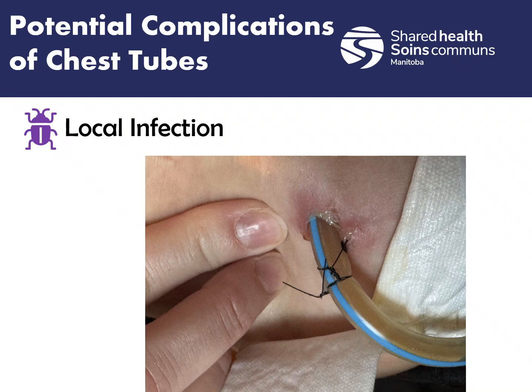If we didn't get a chance to check it before we transport for some reason, we want to make sure we take a look at it and notify the receiving facility that it looks like there could be some infection around the site.